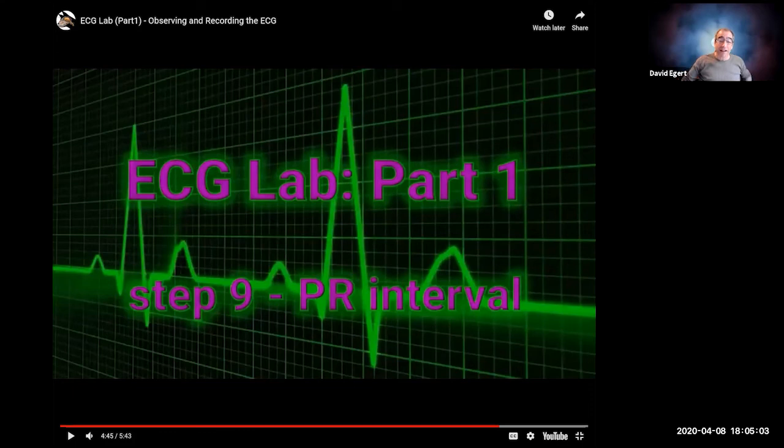Exactly. Right. In fact, all of those muscles that are moving your wrists and arms around are way closer to the electrodes than your heart is. The heart is in here and is sending electrical signals all through the salt water of your body. But if you're doing this, these muscles are right here going. So that's what you saw there, we would call an electromyogram. The electrical signal measured on the skin that is coming from the depolarizations just of the skeletal muscle there.